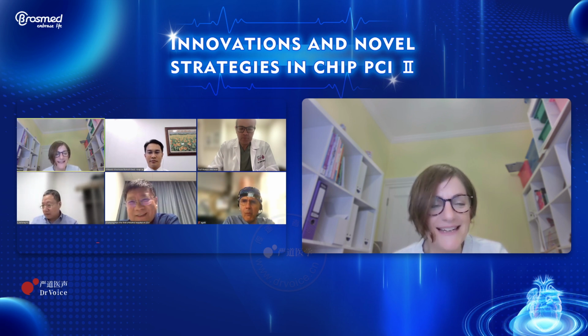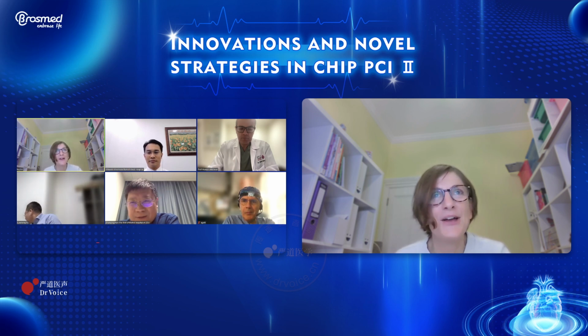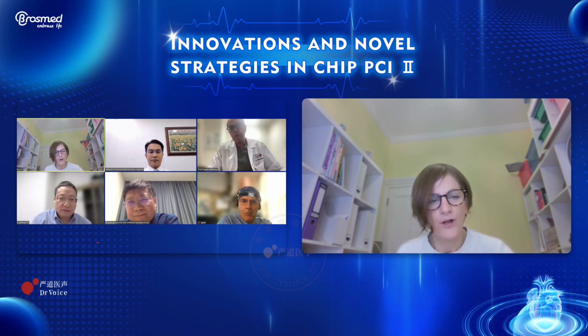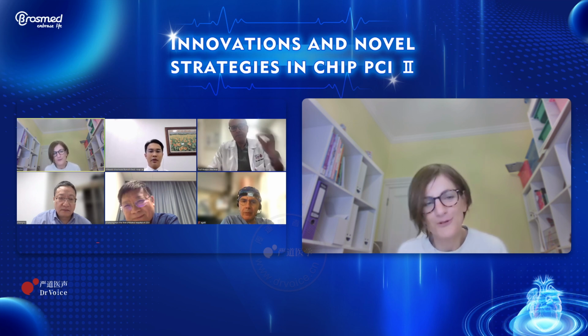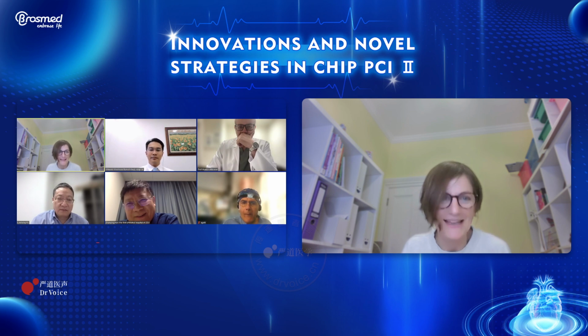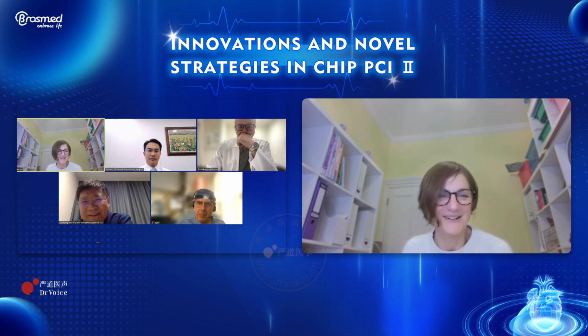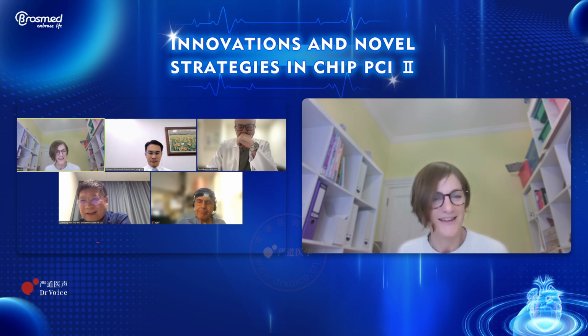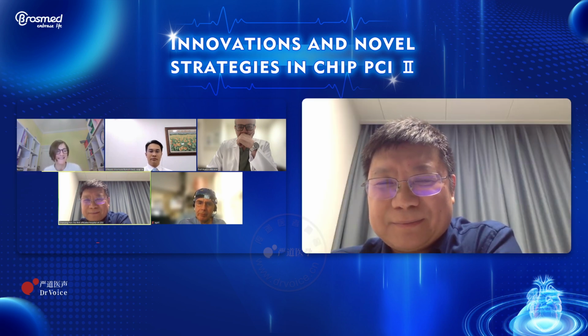Yeah, that's a really good tip. Probably the one guiding catheter we didn't try was a Judkins left, but I hadn't thought of that. But yeah, it's that difficulty, isn't it? If you think the stent is hanging out, are you trying to get your wire through a strut, or through a lesion, or do you even have a choice, you just want your wire to go somewhere? But yes, I hadn't thought of using two guide wires, one to try and secure it and one to penetrate the lesion. That's a really good idea. Thank you.